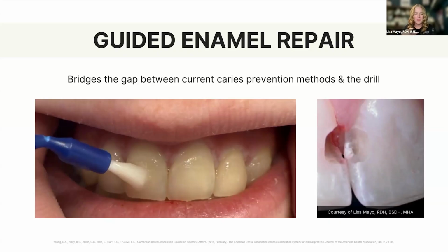That's me putting fluoride varnish, by the way, on my 16-year-old's teeth. That's Braden's anterior teeth there. And that's also Braden's cavity prep that just occurred last year and the drill. So you can see how deep his caries went. And by the way, that lesion, you're looking at the interproximal lingual side of 7 and 8. That decay occurred in a 4 month period of time.